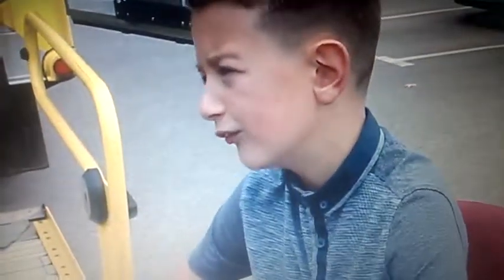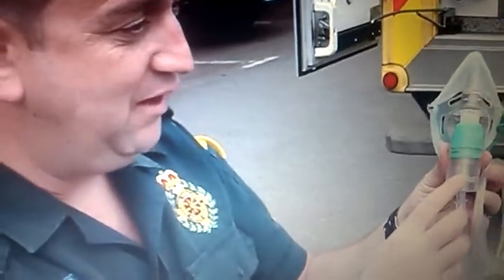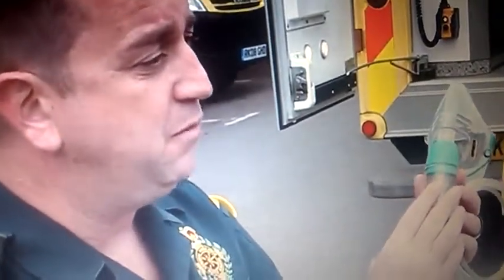What is the mask for? No, these masks won't hurt you. What they're designed to do is to help you breathe easier. This particular mask, if you have asthma, you may have one of those little blue inhalers. Well, the same drug we put into the container in here, and we put oxygen through that, and it's quite noisy and a little bit scary, but it won't hurt, and then that just helps you breathe easier. And we have various masks that we can use to support the oxygen flow around your body, but none of them hurt. They're just to help you breathe a little bit easier.